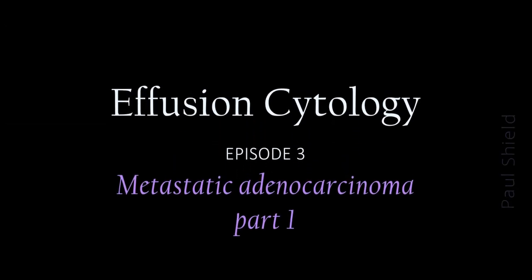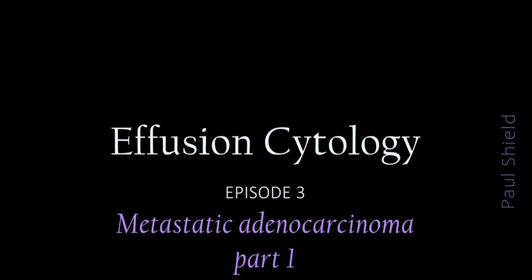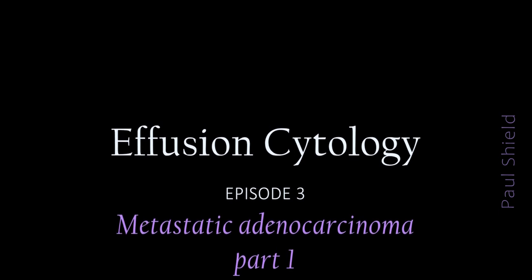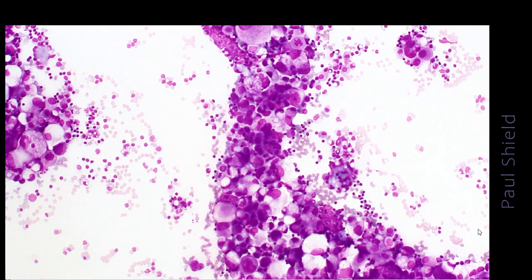It's Paul. In this clip I want to look at the most common presentation of adenocarcinomas in serous effusion specimens. So these are probably the samples that show the classic adenocarcinoma features, and they're quite nice to look at. This is a classic example, an ovarian adenocarcinoma in ascites.